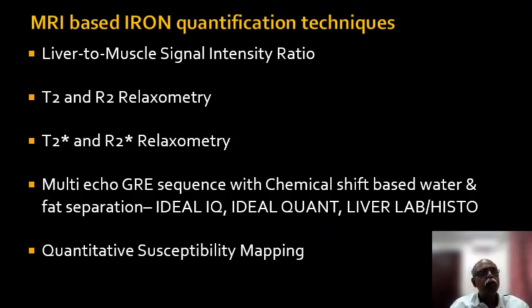So if you use T2, it will take a long time. You can't use breath hold techniques because any T2 you do has to be respiratory gated, and there are a lot of variations in respiration, movement artifacts, and so forth.